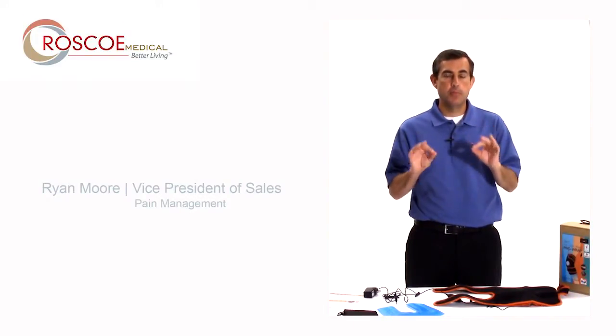Hello. This is Ryan Moore from Roscoe Medical. Hope everyone's doing well. I want to tell you about the Thermetic Knee Wrap.